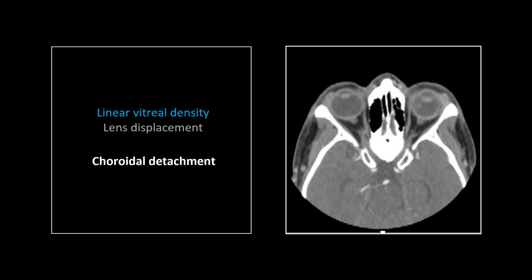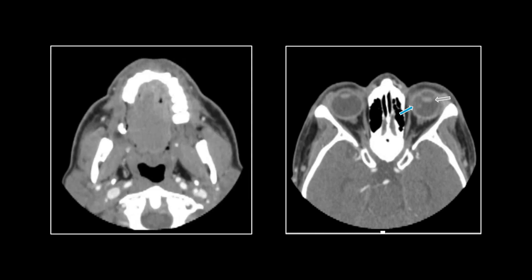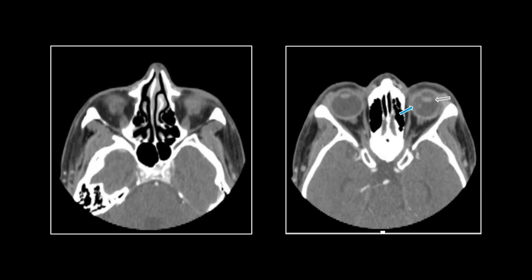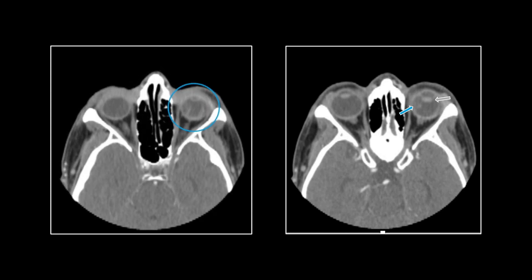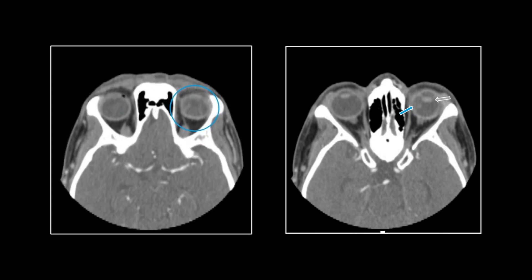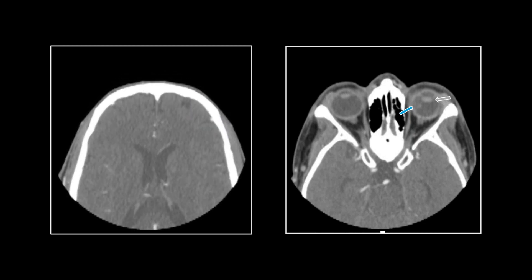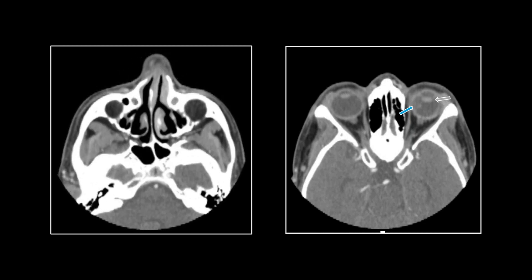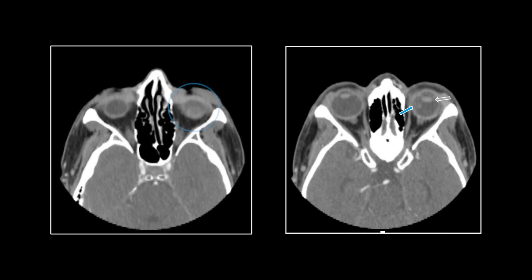This is quite a case. There is actually linear density within the globe — you can see it on both sides. In addition, look at the posterior displacement of the lens compared to the opposite side. So that is a lens subluxation. This was minor trauma that led to this, but that is typically the case. Retinal or choroidal detachment usually happens in a myopic patient but can follow just minor trauma. So even though it was minor trauma, it managed to sublux the lens and detach the retina or choroid.